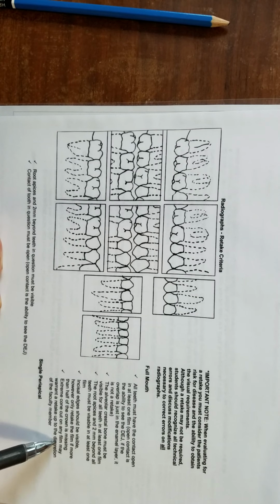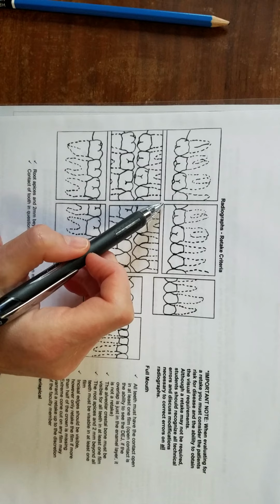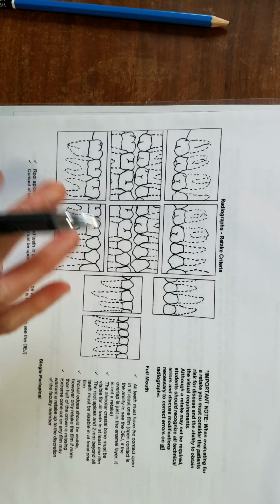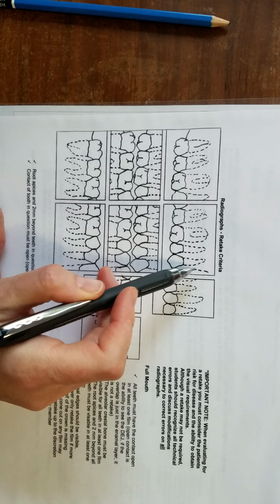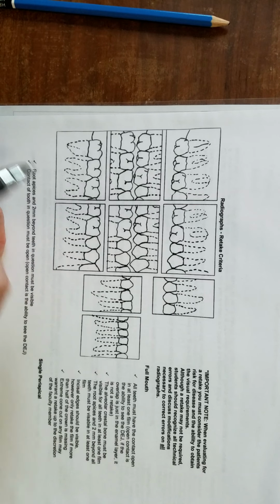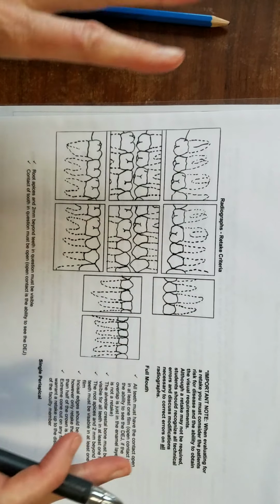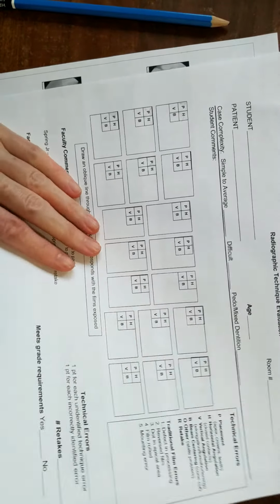Extreme cone cuts on any film may warrant a retake up to the discretion of the faculty. So if you've cone cut half the film and you can't see something anywhere else, we would retake it. But if it's just a small one that nicks off a little bit, you don't have to retake it. If it's seen somewhere else, then it's okay. All right, so I want you to be familiar with that, and then radiographic technique evaluation.